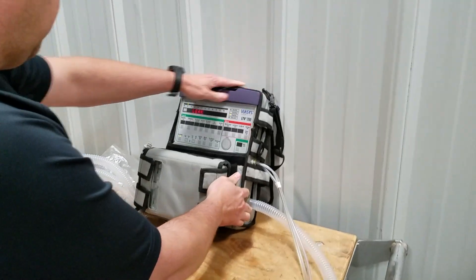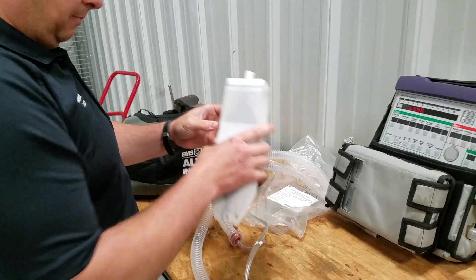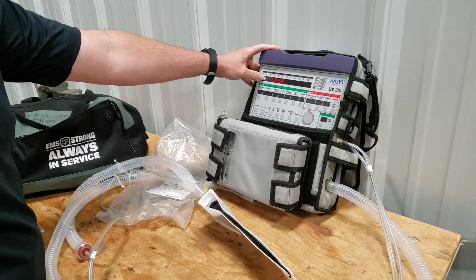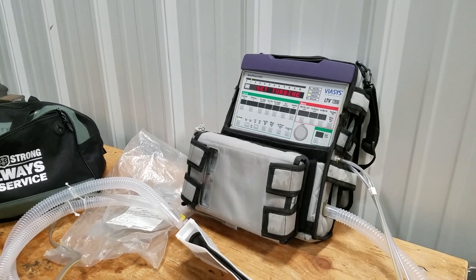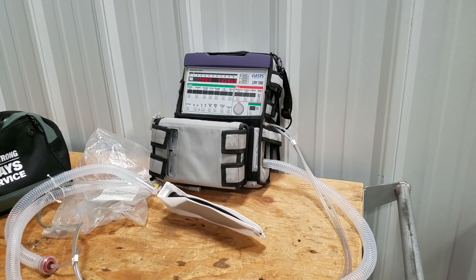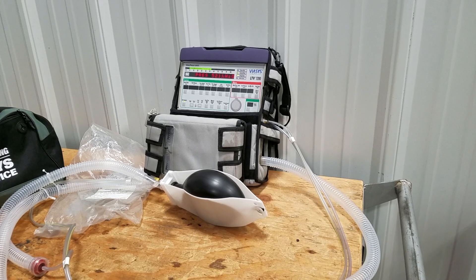Once they're hooked up and tight, we're going to take the test lung out of the accessory bag and hook it to the vent circuit. Now we're ready to go ahead and hit select. You'll hear the vent starting to power up, and in just a second you'll see the test lung go ahead and inflate as it starts its leak test.